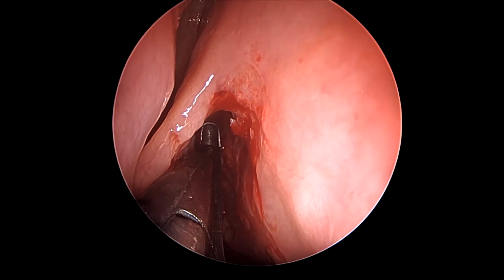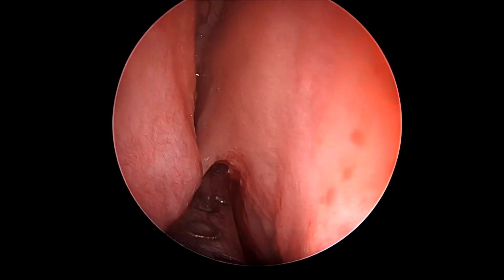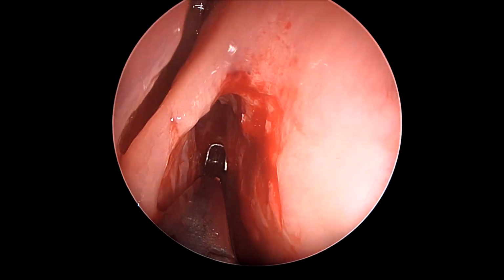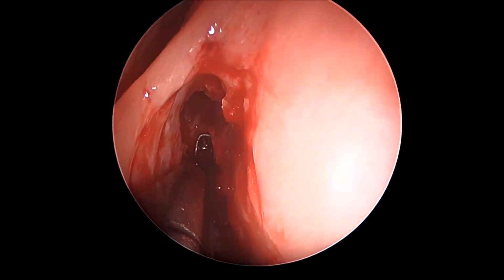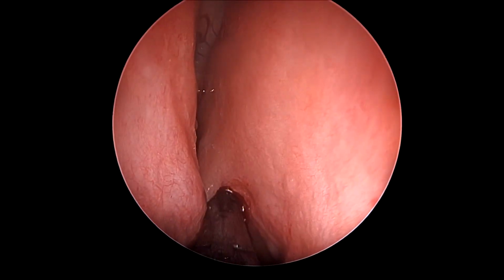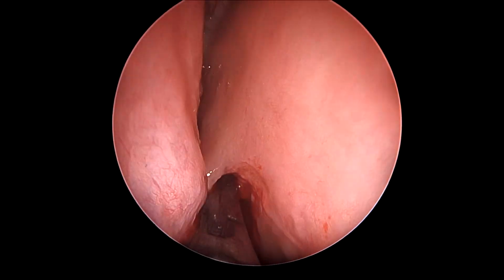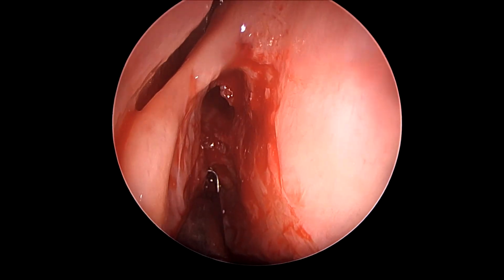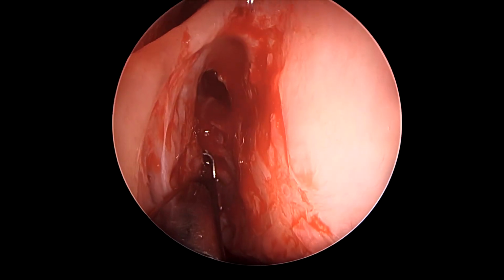So now we resort to an articulated frontal sinus punch to clear some more bone of the frontal beak, and to create more space for ourselves anteriorly, so that we can identify all the cells inside the frontal recess area that go high up inside the frontal sinus, to be able to remove them conclusively under vision.